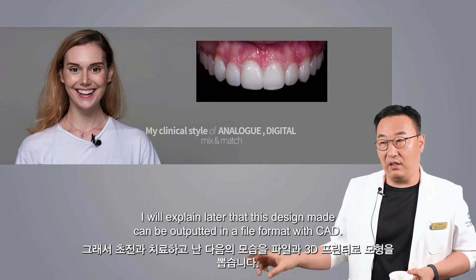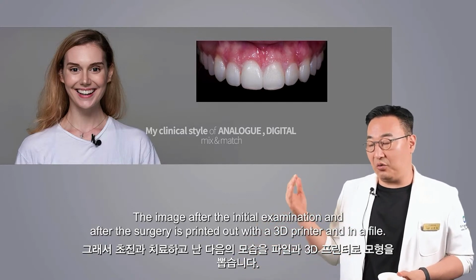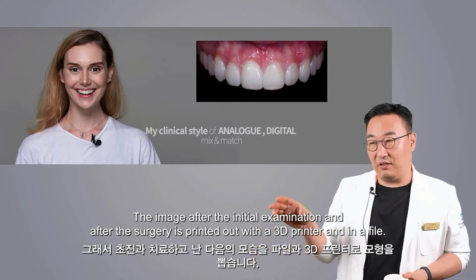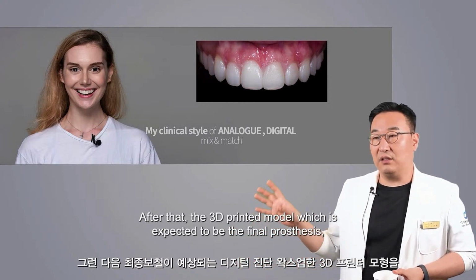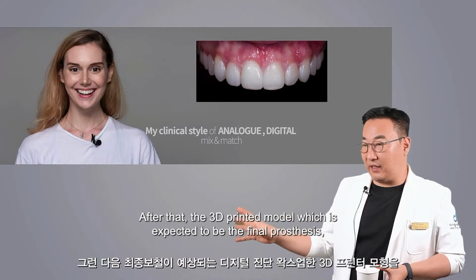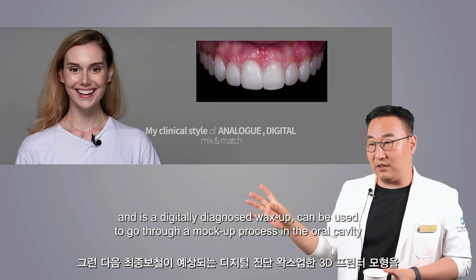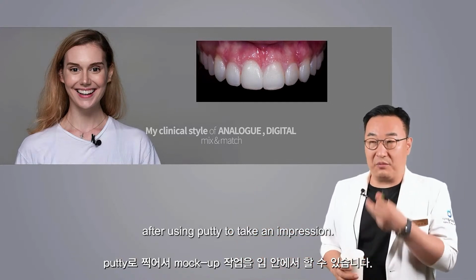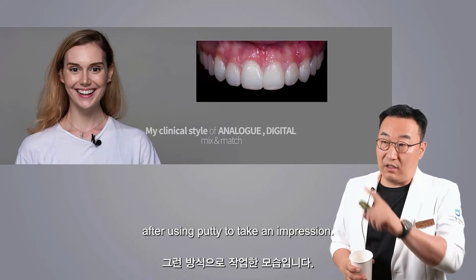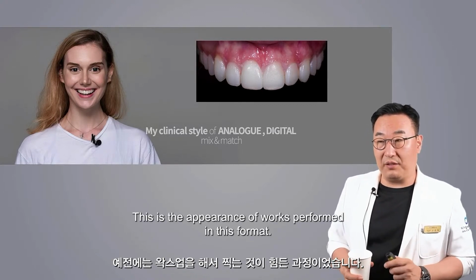The image after the initial examination and after the surgery is printed out with a 3D printer and in a file. After that, the 3D printed model, which is expected to be the final prosthesis and is a digitally diagnosed wax-up, can be used to go through a mock-up process in the oral cavity after using putty to take an impression. This is the appearance of works performed in this format.